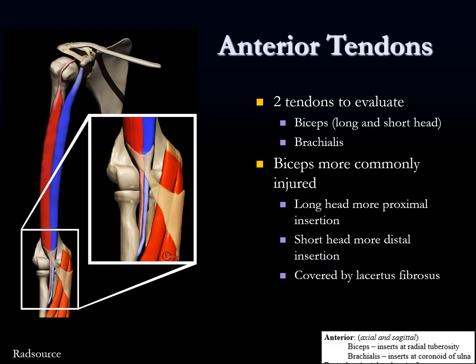We're going to start with tendons. There are two main structures to evaluate for tendons in the anterior elbow: the biceps, which has a long head and a short head, and the brachialis. The long head biceps tendon — which we know from shoulder MRI as going through the bicipital groove — has a slightly more proximal insertion on the radial tuberosity. The short head comes from the coracoid process and inserts more distally.